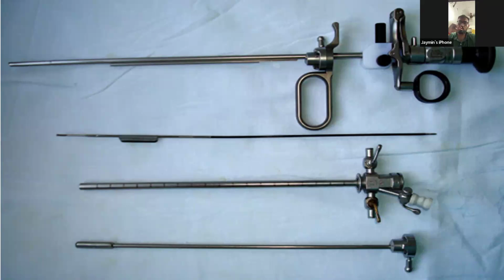Resectoscopes are monopolar, bipolar... and rotating. Rotating resectoscope, sir.